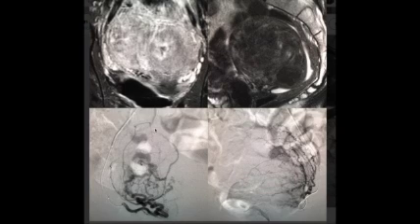the spine. And then finally, here are images from the actual arteriogram showing the catheter coming in and into the artery that supplies this fibroid tumor, and it's on the other side, the left side. This was done from a pinhole in the wrist, and using the embospheres, which I showed earlier, we cut off the blood supply to this fibroid uterus, and the patient's bleeding and symptoms resolve very, very quickly as the tumors shrink over time from lack of oxygen and other nutrients that are within the blood.